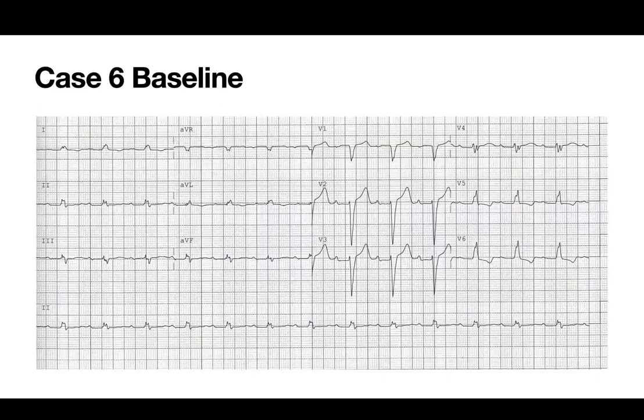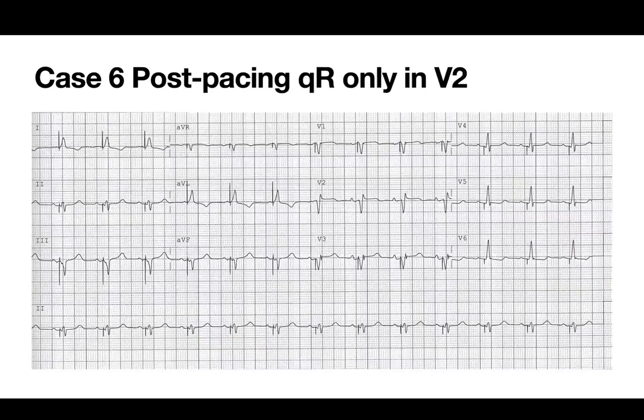Go next. Okay, there's a post-TAVI patient that got left bundle branch block, again with the double peak. Go next. One thing else I wanted to illustrate in this particular case was that the QR was only present in V2, and I heard this from other colleagues that were seeing that too. So if you don't see it in V1, I think looking at V2 is very useful. Because sometimes if you see a rapid transition in V2 or you see a QR in V2, you might be okay. Like in this case, Dr. Philippon was saying, do you do another 1 or 2 turns? And trying to get smart to do another 1 or 2 turns, and then you're going to perforate.